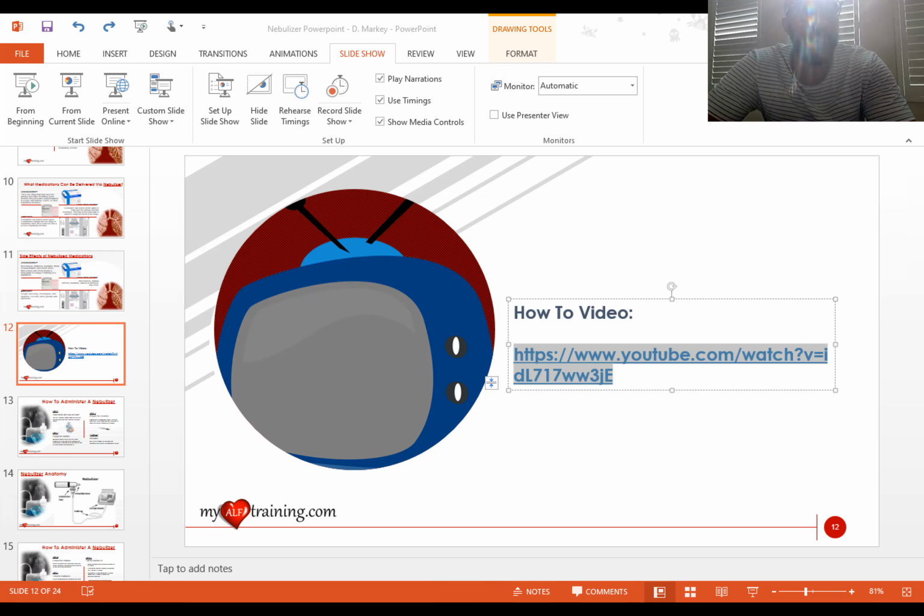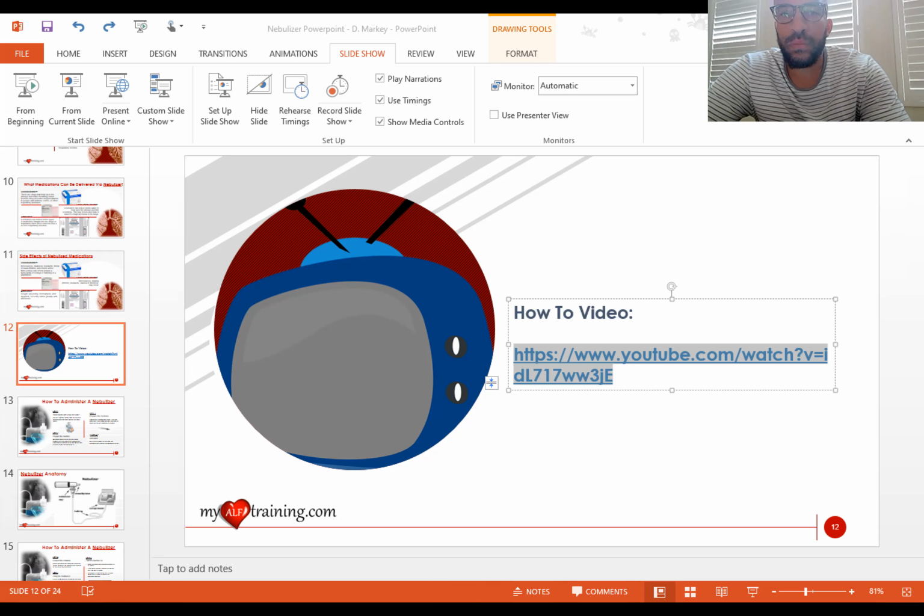You may want to check the nebulizer to ensure proper vertical orientation. Next, I'm going to connect the nebulizer to our gas source using oxygen tubing. It should be noted that in order to adequately power jet nebulizers, a specific gas flow is required for this device. The manufacturer in this case recommends 9 liters per minute. However, it doesn't necessarily matter what type of gas. It could be 100% O2, air, heliox, etc. You'll need to exercise good clinical judgment to determine the appropriate gas for your treatment.